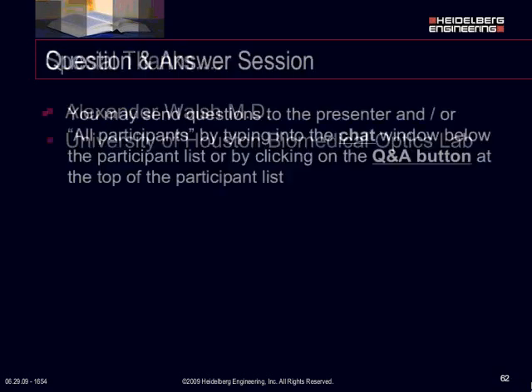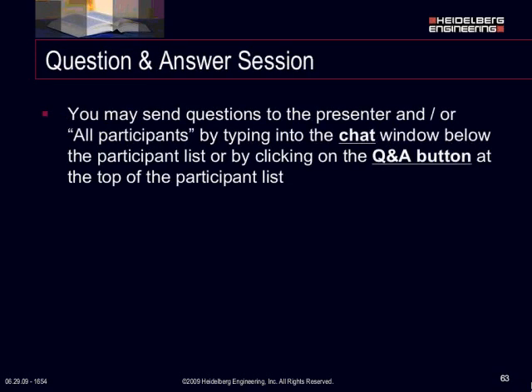If you have any questions, I'd love to entertain them now. Excellent. Thank you so much, Tim, for that excellent presentation. We have a couple of questions.